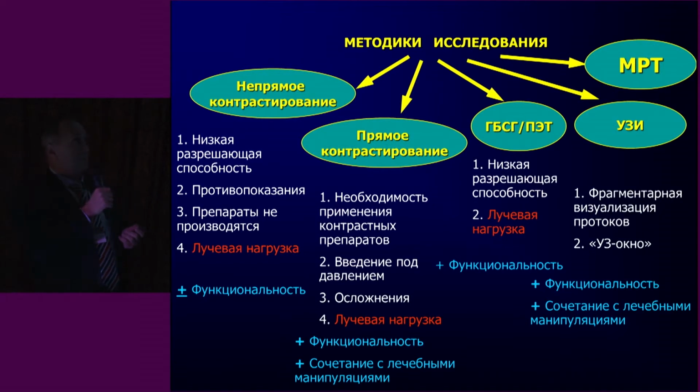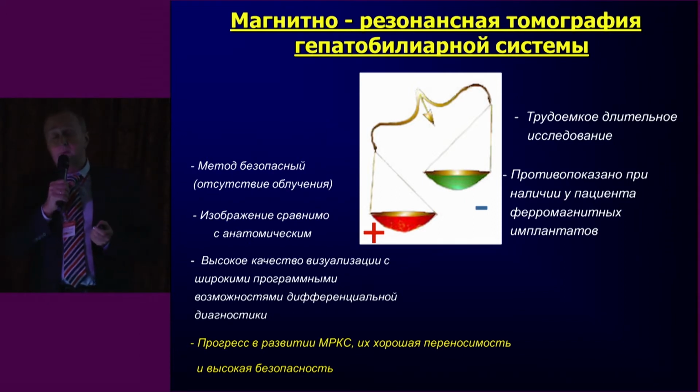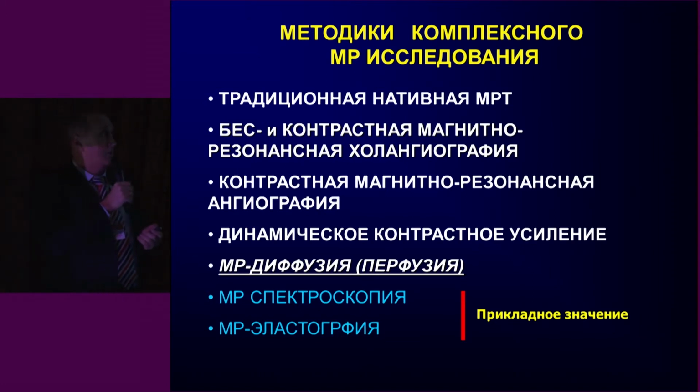But nevertheless, if we talk about the examination methods and imaging modalities, you know that they have their advantages and disadvantages. And MRI is a very specific technique which per se has a range of advantages, and it does not have that many contraindications. Most of them are relative, so to say.